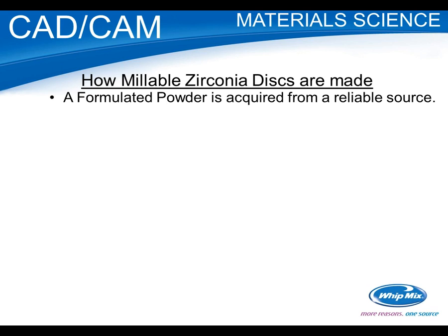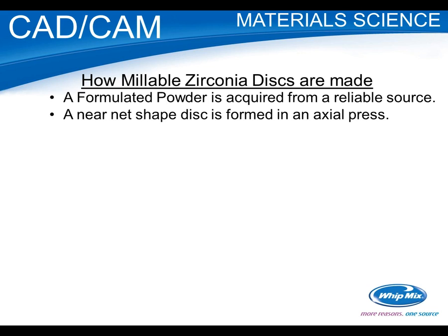I think most of the suppliers of zirconia found the problems early on. There's an issue with radioactivity because one of the isotopes found with zirconia in nature, I think it was thorium, has a low level of radioactivity. So if you look at specs on zirconia, they still include a requirement for radioactivity, though I don't think that's really an issue anymore. But the quality of that powder is important. Currently there are only a few providers, but down the road there may be more, as people see this taking off and others jump in. So just make sure your discs are made from a reliable powder source.